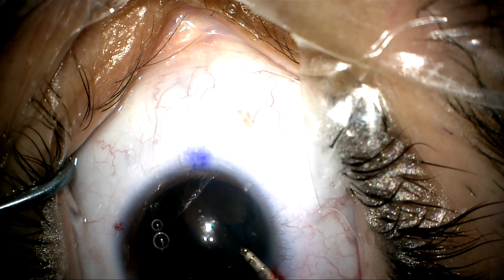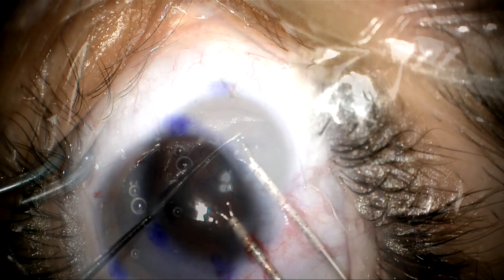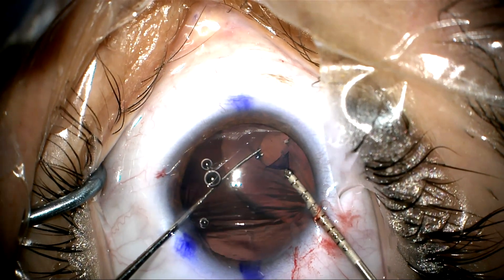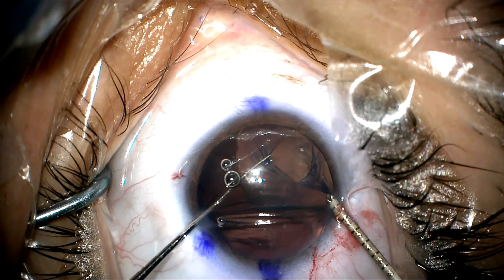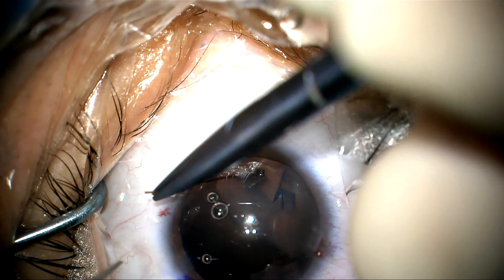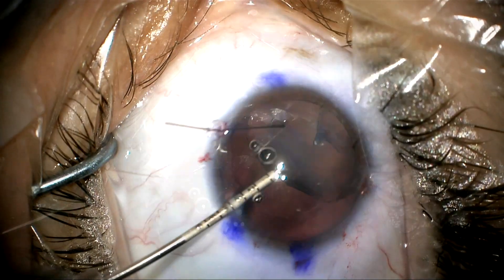Now we're going to start to tear, and the problem is that there's really no counter-traction because the zonules are poor on this side. The other side has some zonules — that's why the whole lens is pulled over — but on this side there are no zonules. So we're going to use a Kuglen hook to provide some counter-traction, and now I'm going to place an iris retractor to stabilize the anterior capsule.